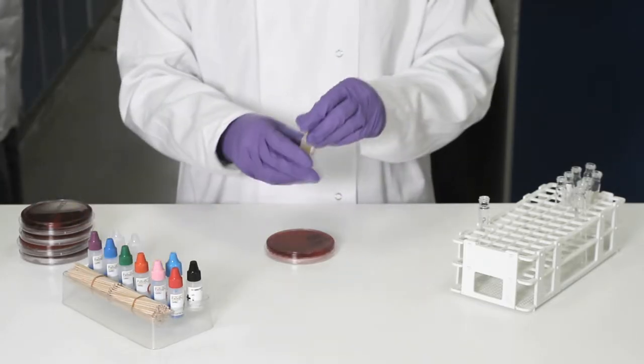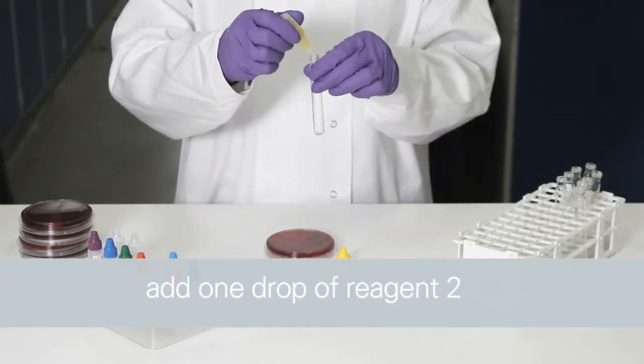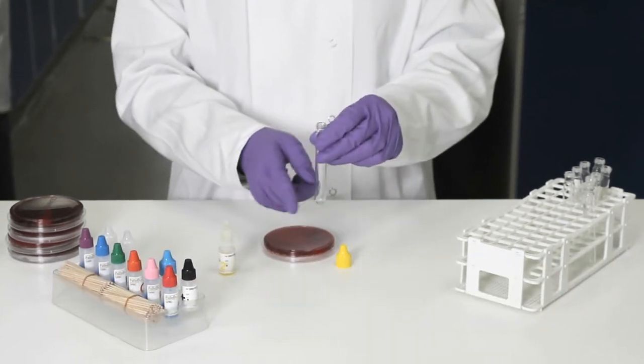Now add one drop of reagent 2. Tap gently.